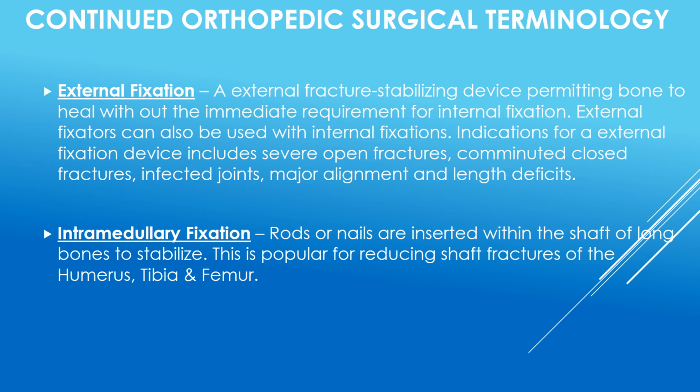Intramedullary fixation. Rods or nails are inserted within the shaft of the long bones to stabilize. This is popular for reducing shaft fractures of the humerus, tibia, and femur.